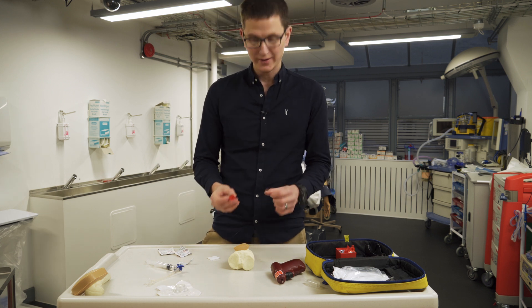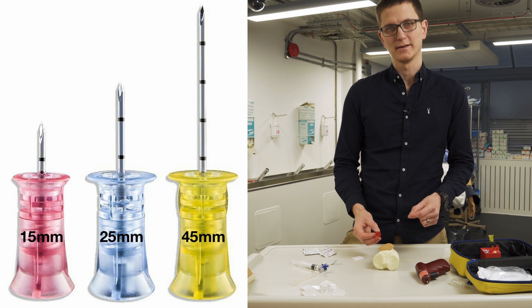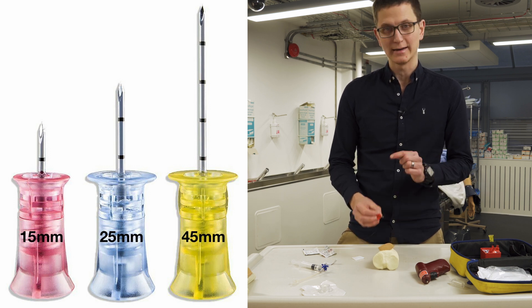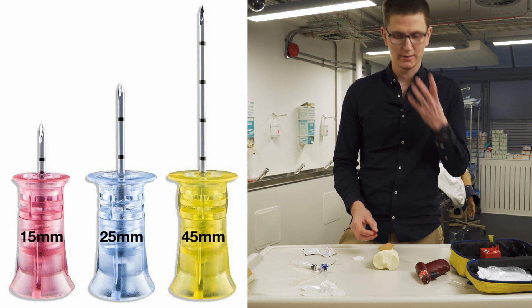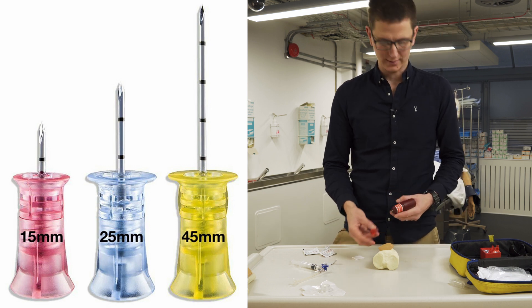How do we know how big a needle we need? On the needle there are black lines. What the manual says is that once you have stuck the needle through the skin, a black line needs to be visible. If you can't see a black line, it means the needle is too small and you need to get a bigger needle. You get small needles, then bigger, then really big needles.